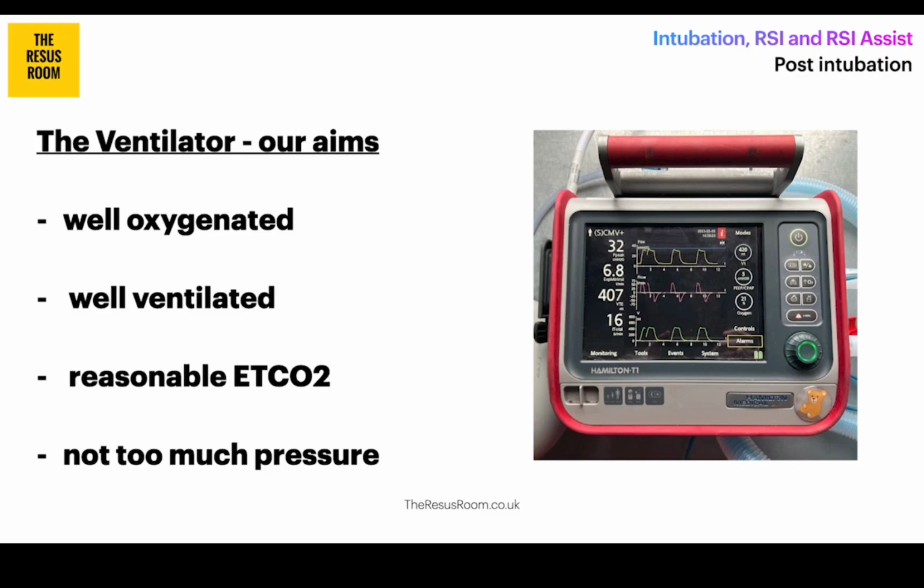The final wish here is that we don't go using too much pressure to deliver these breaths. And this can potentially result in barotrauma to the lungs, along with increasing the cardiovascular instability and problems that are caused by invasive positive pressure ventilation.